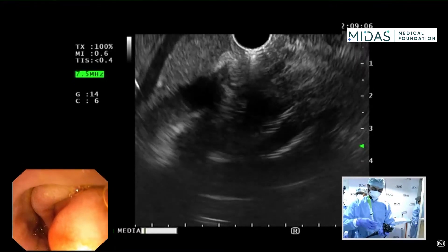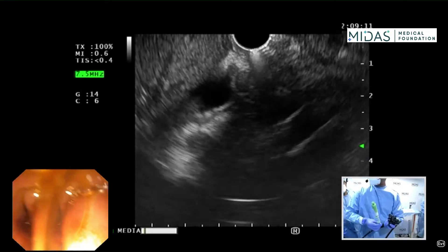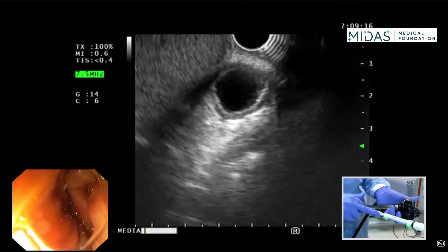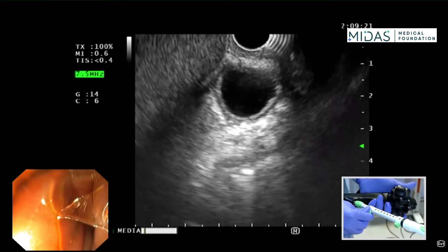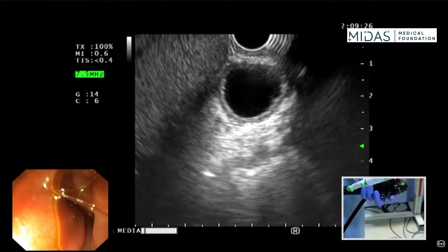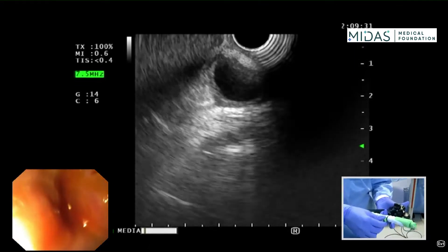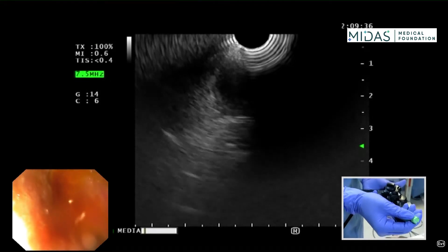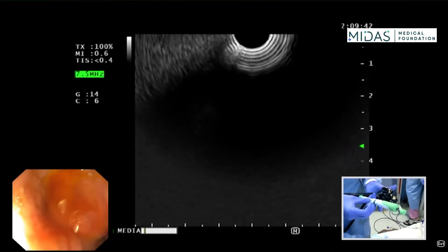As I push this out, I'm going to screw the FNB needle in. What I want you to see is that this is set at position one — this is how much the needle is going to come out of the scope. I like to keep it at one depending on the situation. Then we pull the stylet out. I'm going to use the slow-pull stylet technique today for demonstration — pulling the stylet out slightly, then unscrewing the needle.